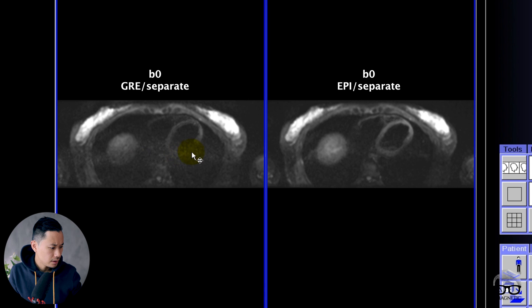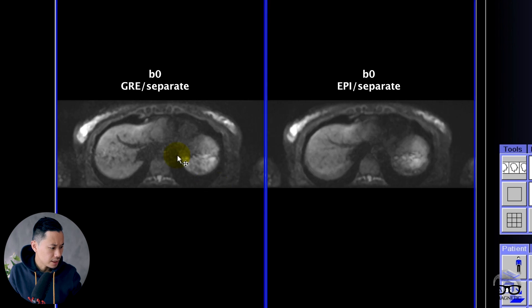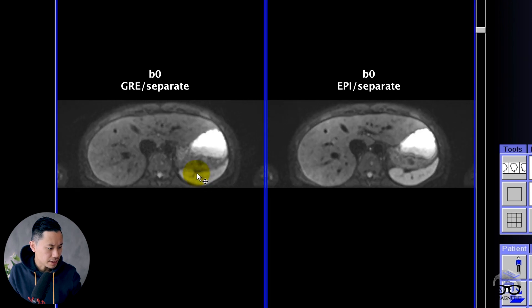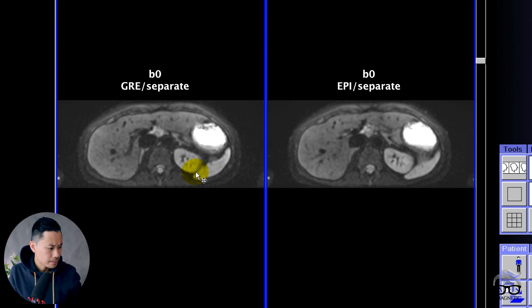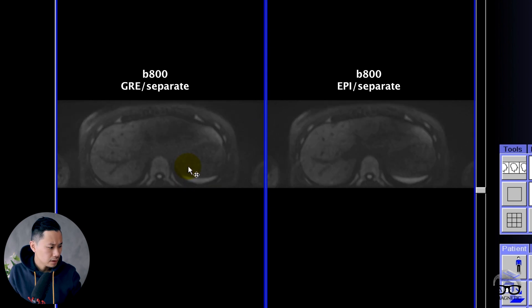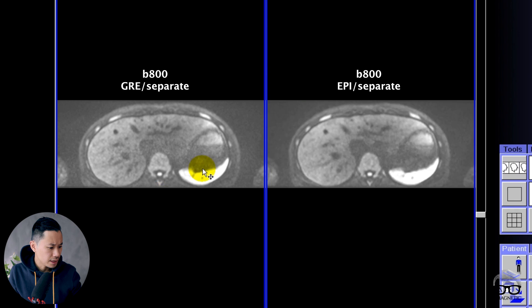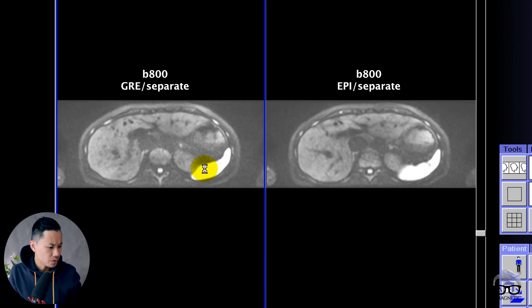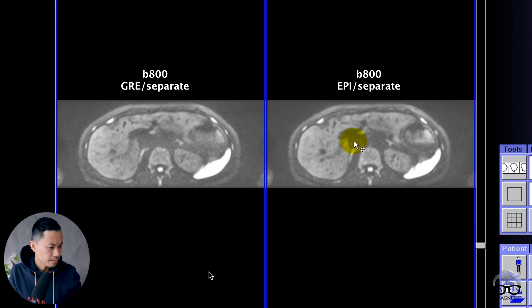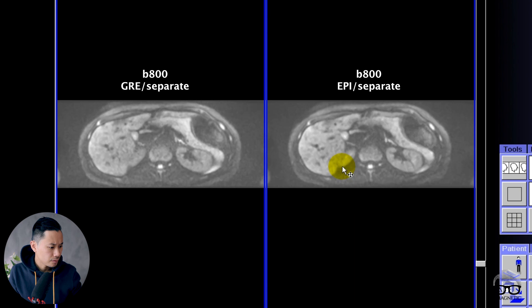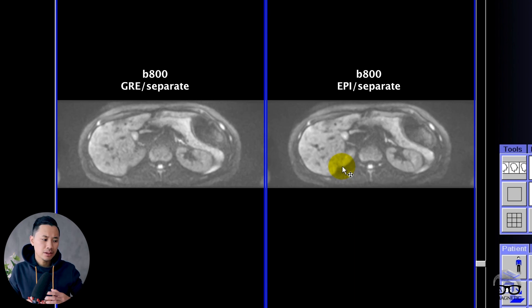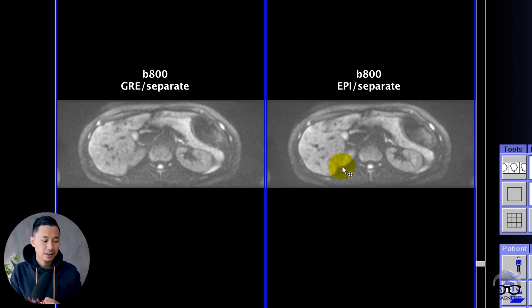Let's scroll through here — you can see the differences. This is B0, and let's go to B800. You can also see here much more noise on the gradient side. I feel like whenever you're using the EPI mode, you can push the limit a little bit further without seeing the artifact.